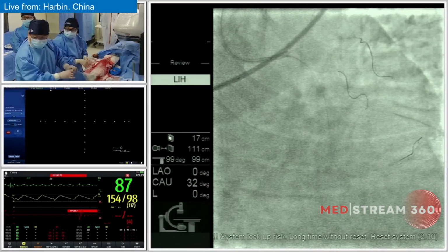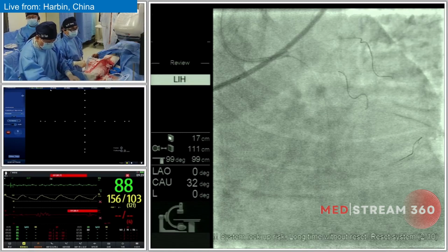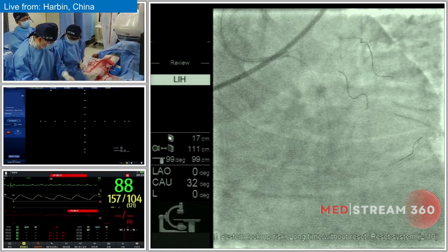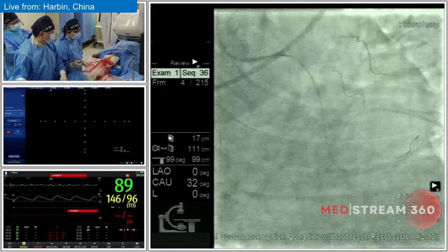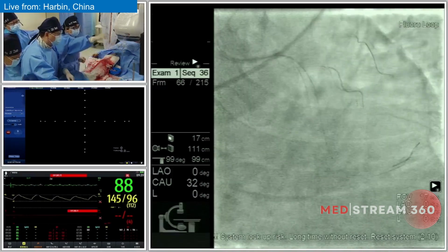Give me a little contrast. Here, here, here. Okay. No, no, no. Left. Okay. It's about here. Okay.